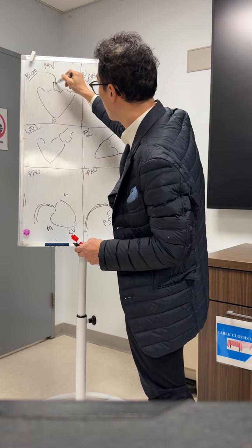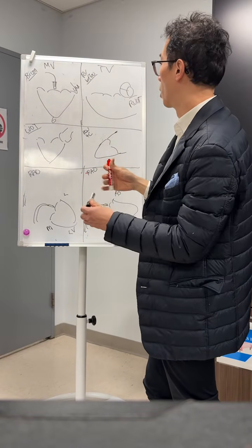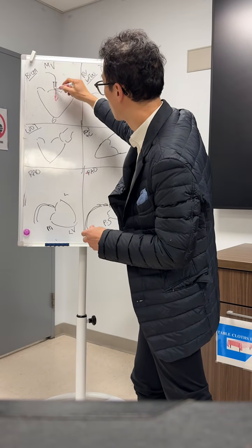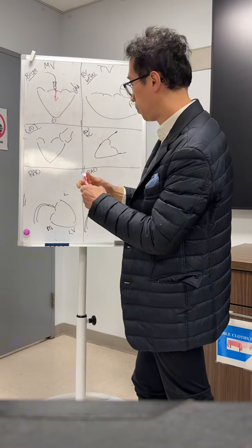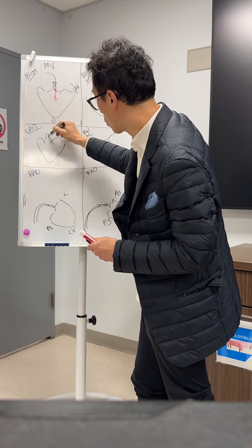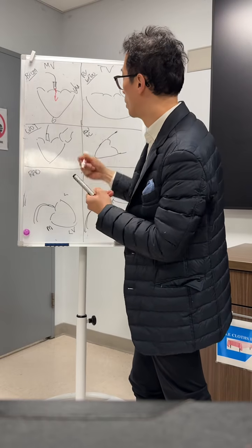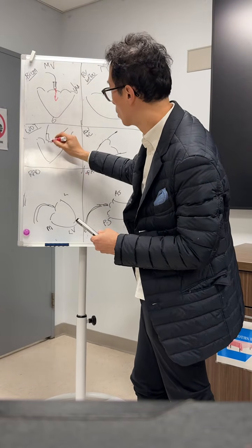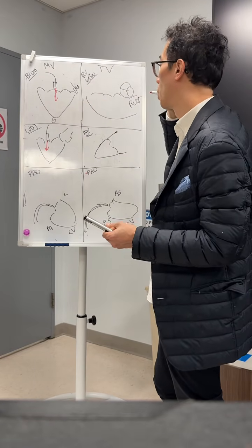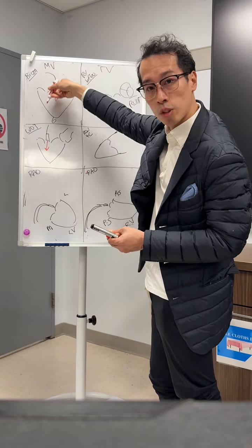You're already ready to go in the ventricle, so you want to go in perpendicular. That's what I mean. So if you go in perpendicular, here you have your device. We always like to go in close because you don't want to get entangled with any cords. So you want to go in centrally and straight. There are two components, remember, it's a two-dimensional steering. So you don't want to go this way, that's lateral dive. You don't want to go this way, that's medial dive.